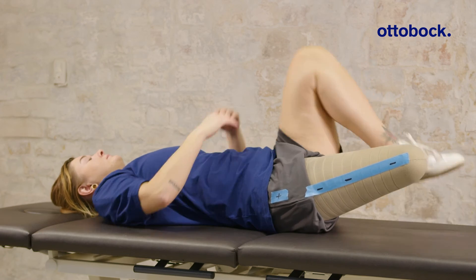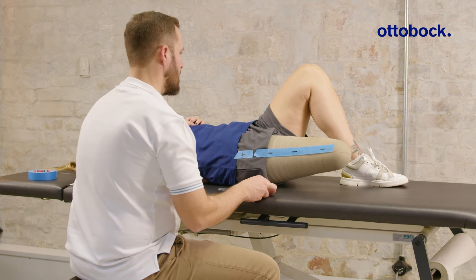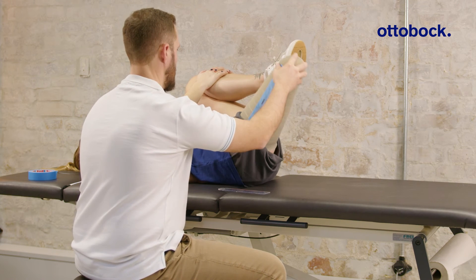Have the user pull the sound knee towards the upper body and make sure the residual limb rests in a relaxed position. Slide one hand under the lumbar spine. Move the residual limb with the other hand while the user keeps the hip muscles relaxed.